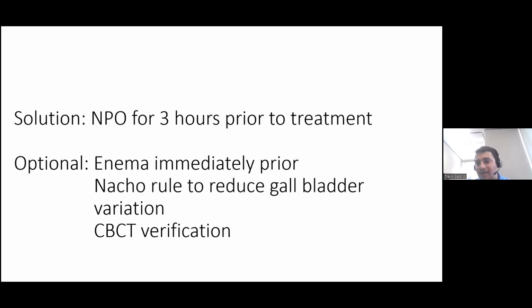And then lastly, cone beam CT verification. That's the easiest way to ensure that there's no motion, both between fractions, when you set up the patient initially, as well as if you're administering a long treatment, to ensure nothing has changed. For example, we have SBRT cases that can sometimes take up to 15 minutes of treatment. I'll talk about this on the next slide, but for bladder especially, but including rectal filling or peristalsis, this could be a long enough time period where you do see an effect.